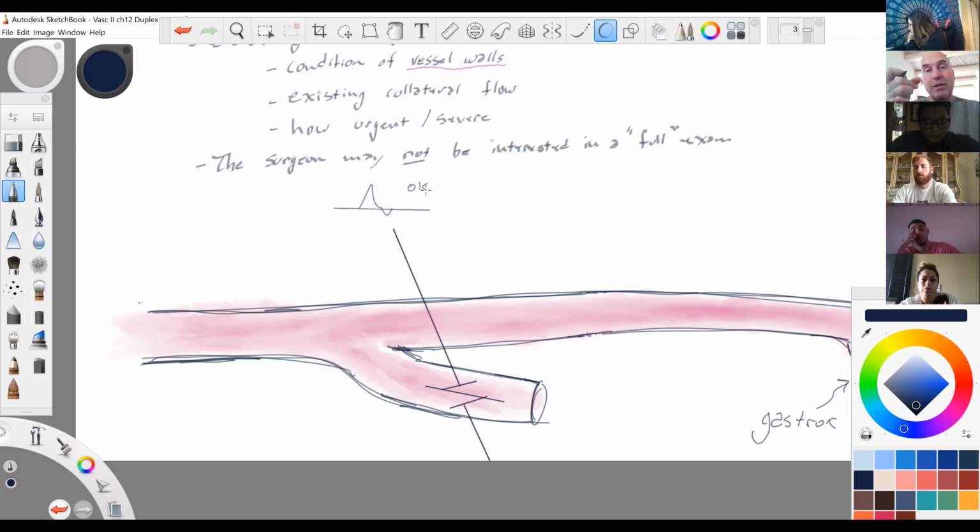Now remember, you could take a triphasic flow, and if you have a poor Doppler angle, as in steering and heel toeing, you may miss triphasic flow. So you really have to get on your toe, get on your heel, steer. Angle correct is not going to make a difference. Angle correct only changes your velocity, not the actual waveform. So let's exaggerate a picture here.